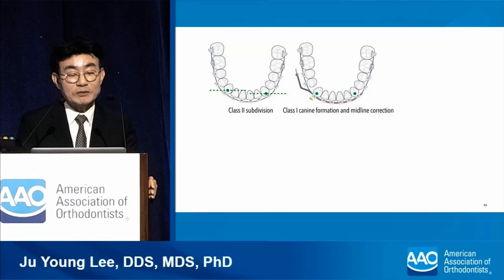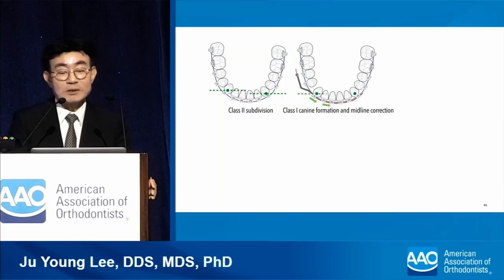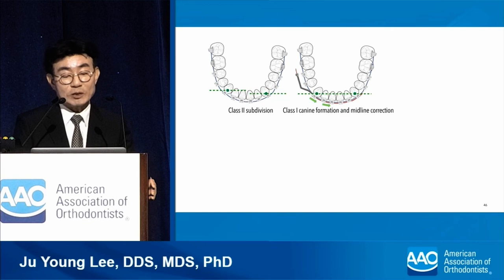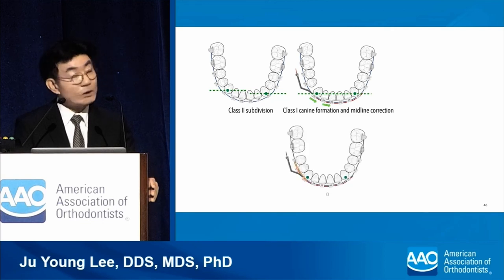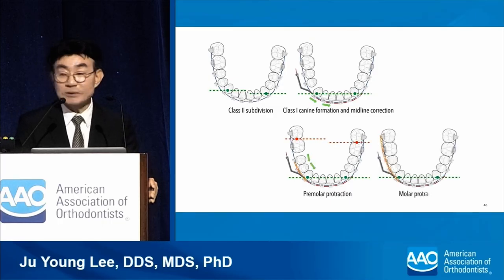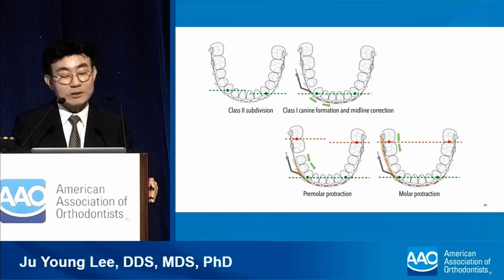By using this pushing force, the symmetry can be restored with horizontal as well as vertical stability. While the teeth move to form symmetry, the main arch wire and TAD-supported segmented arch wires work together to maintain the stability of the entire arch.